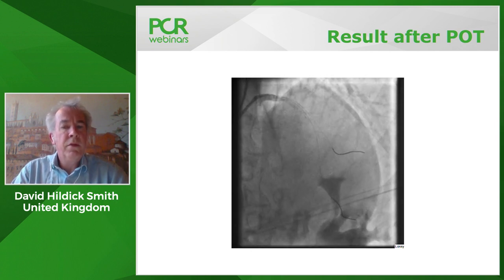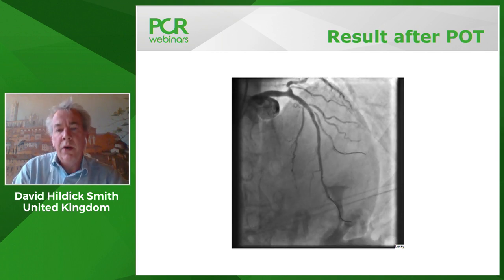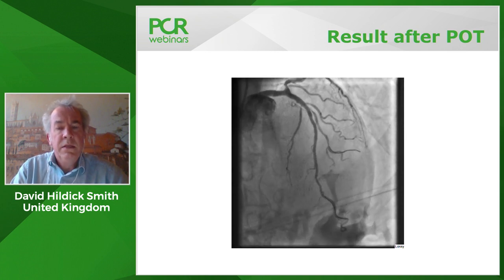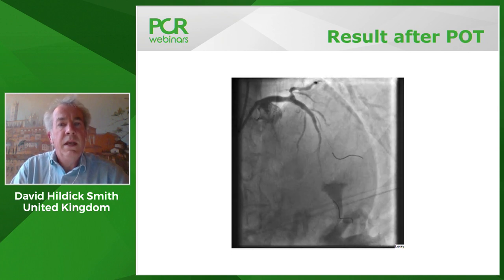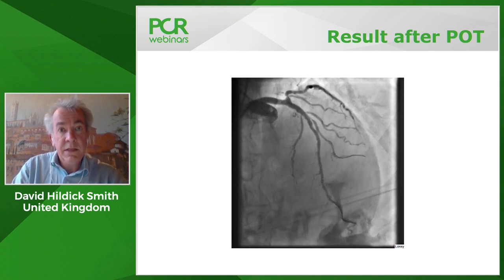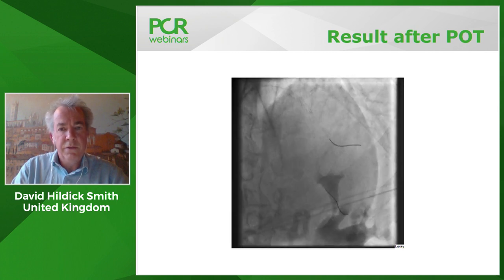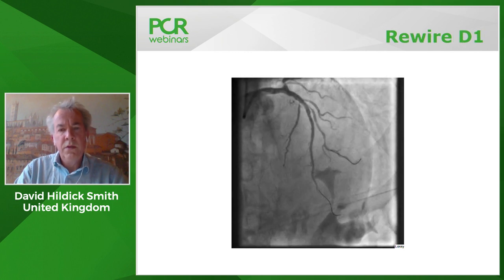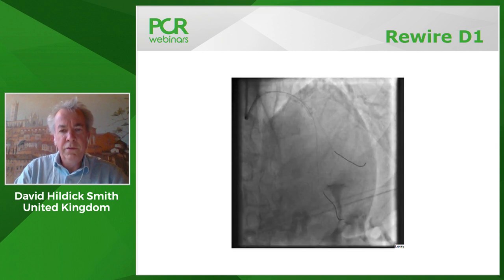Now, I don't have the recording, because, of course, we don't record the actual process of the rewiring every time. Personally, I will leave both these wires in place, take a third wire, put it on a slight loop through the stent, and then come back slowly and try to recross at a relatively distal stent strut to follow the other wire now into the first diagonal. So we've now rewired and are ready to move on to the next step.